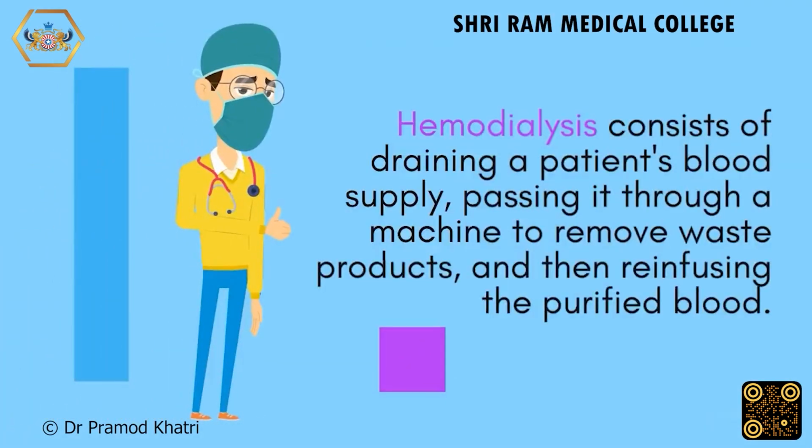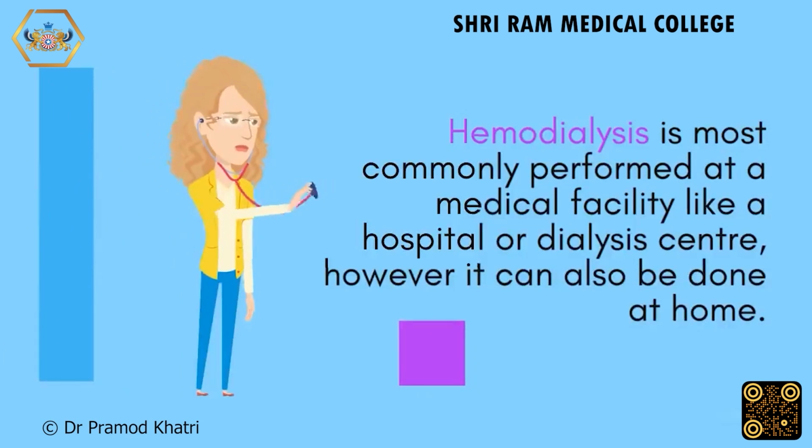Hemodialysis consists of draining a patient's blood supply, passing it through a machine to remove waste products, and then reinfusing the purified blood. Hemodialysis is most commonly performed at a medical facility like a hospital or dialysis center, however it can also be done at home.